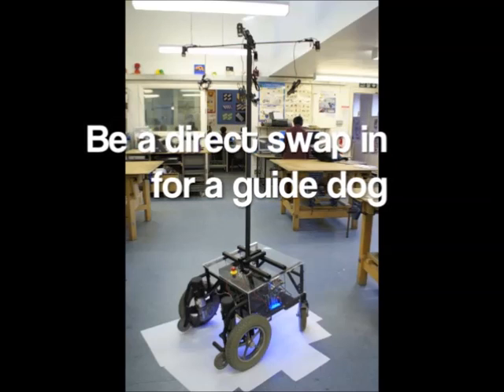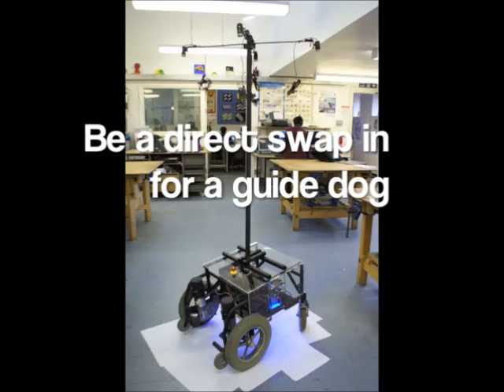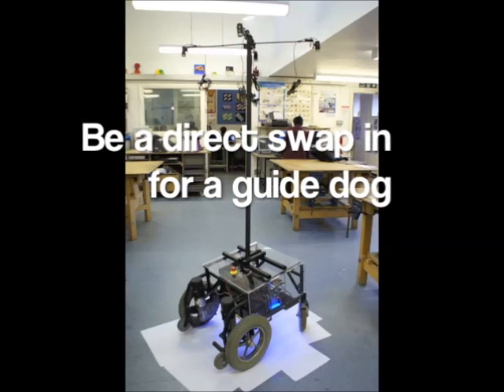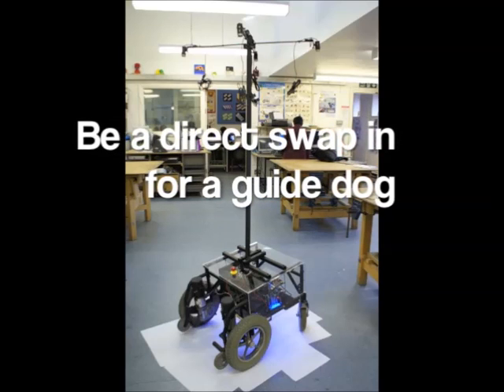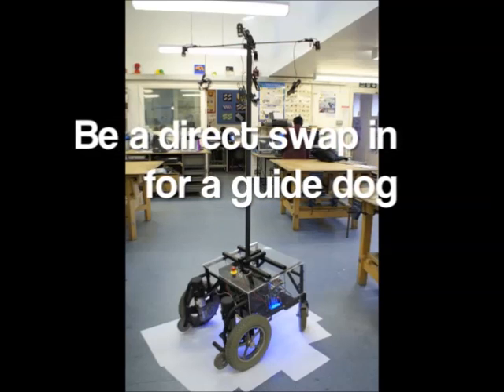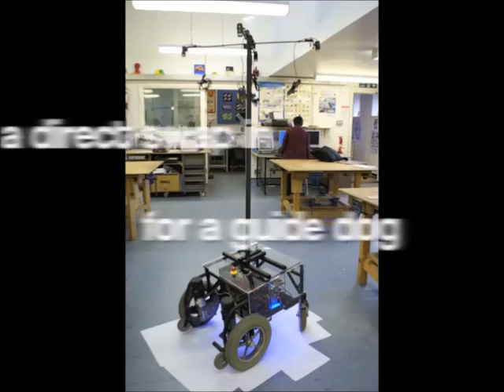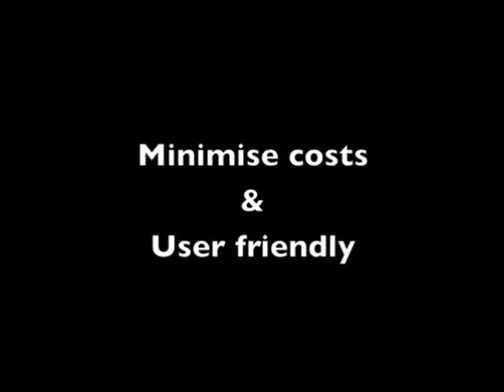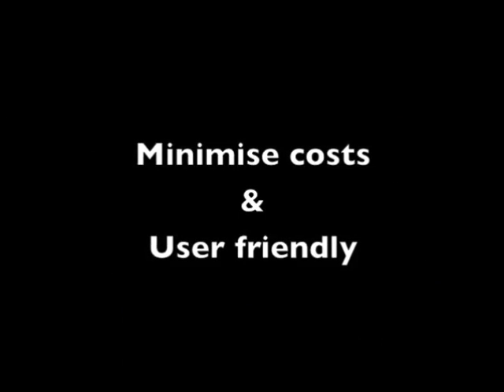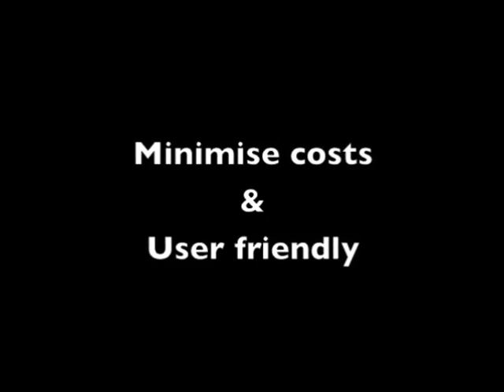The robot is designed to be a direct swap-in system for a guide dog so that no retraining of the user is necessary. This helps to minimize costs as well as allowing users to stay in their comfort zone.